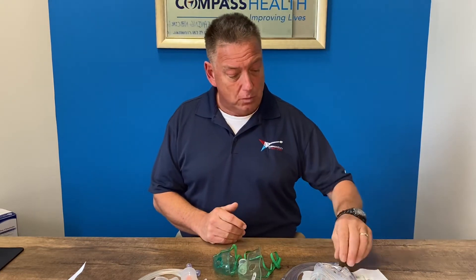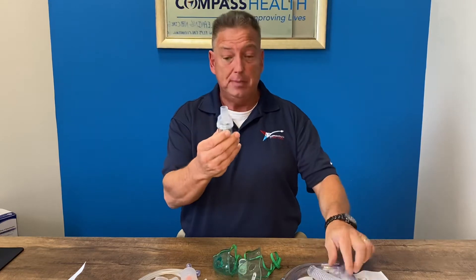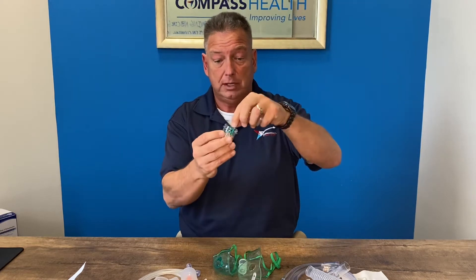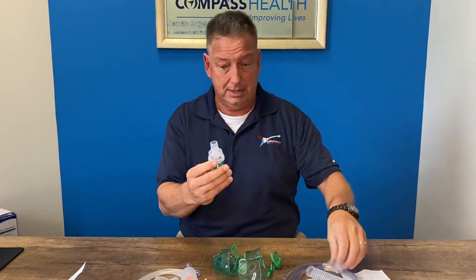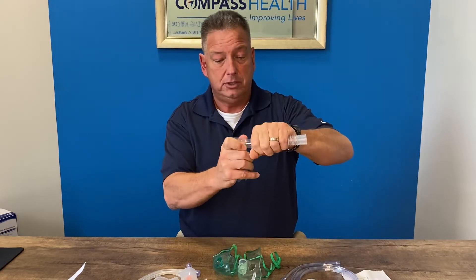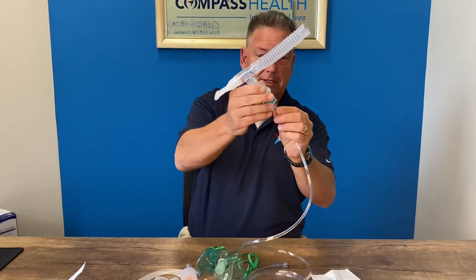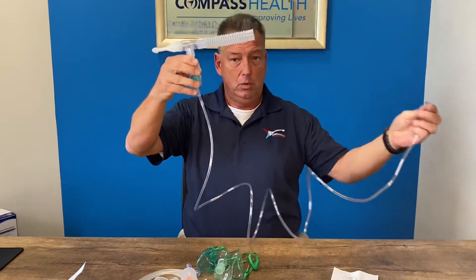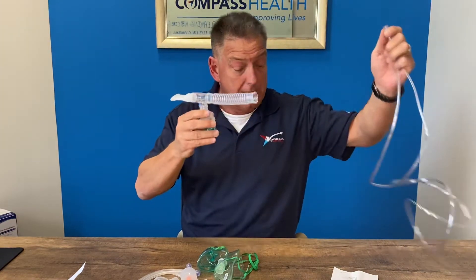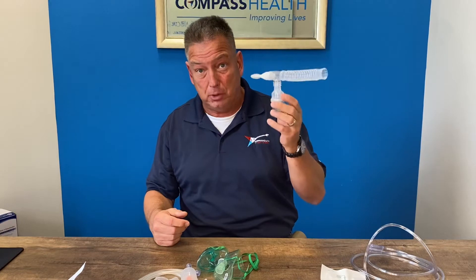First, we'll start with our Roscoe disposable nebulizer kit. It contains your medicine cup where the medication goes. There is a removable triangle piece that needs to be removed when cleaning. Put that together, put your T-piece on, slide on your corrugated tubing, and insert your mouthpiece on this side. Your tubing connects to the bottom and goes to your nebulizer compressor. This medicine cup is featured in quite a few of the different nebulizer compressors offered by Roscoe Medical — this is the Roscoe Medical disposable nebulizer circuit.